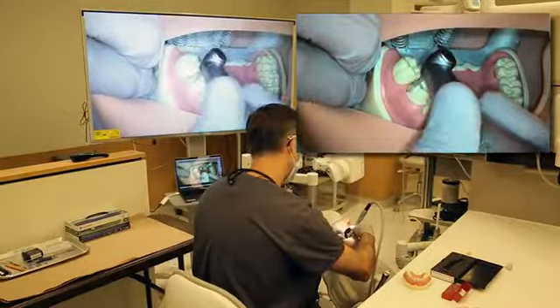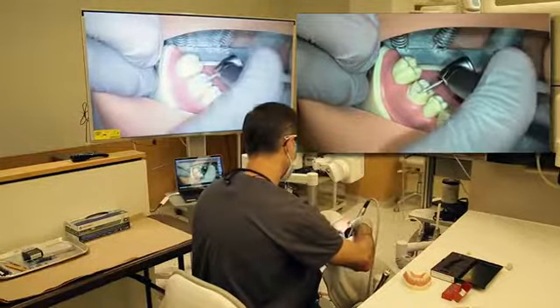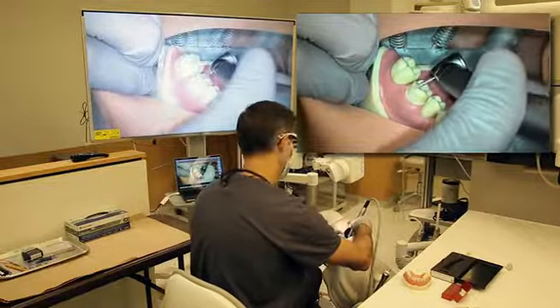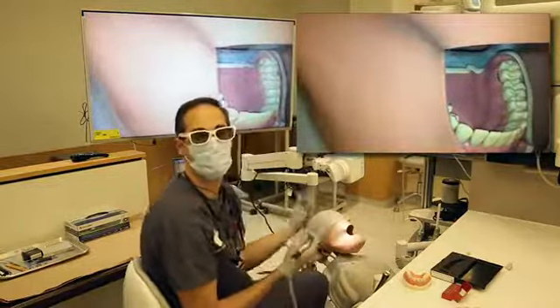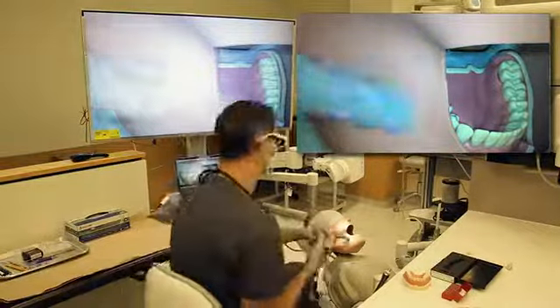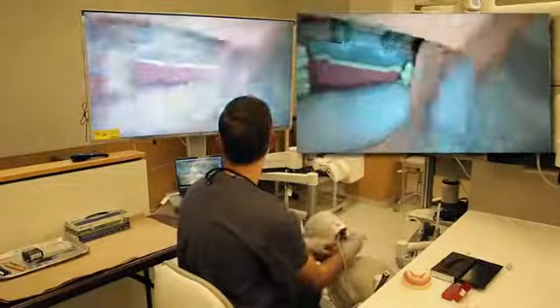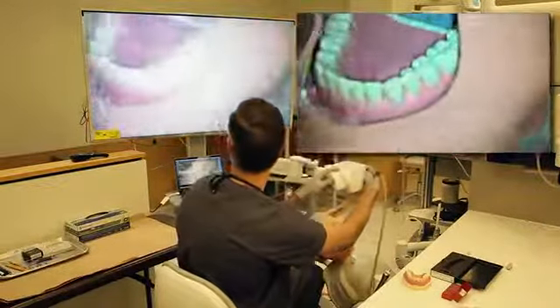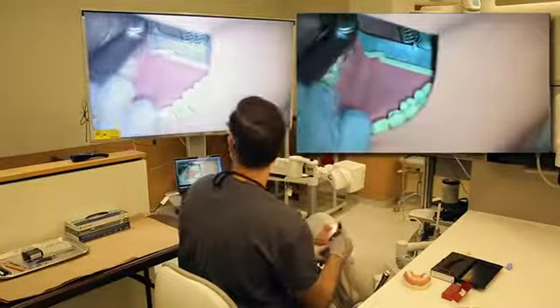So as I'm preparing here, or working along this structure, or trying to show them how I would create certain areas, this can all be done on a large 3D camera in order for them to be able to not only evaluate the work, but in order to see exactly what we're doing intraorally. So this has been a really nice tool, and again, something that can be used clinically, especially for patients that are maybe harder to work with. We have a nice large view.